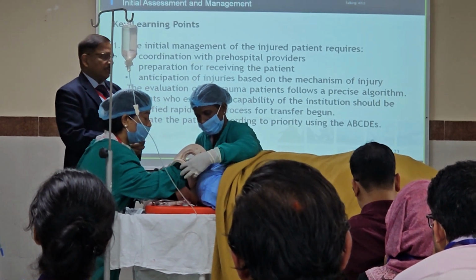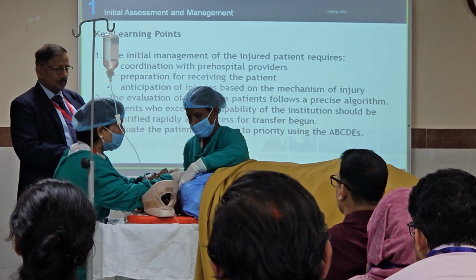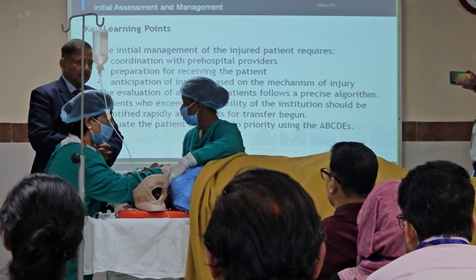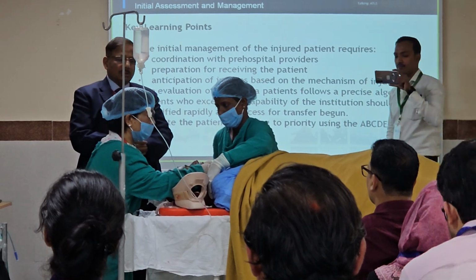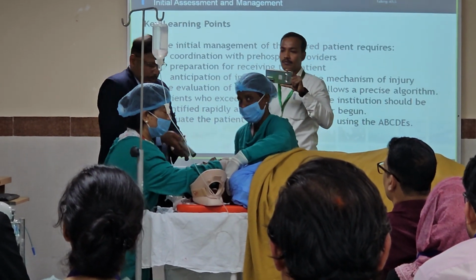What have you done? I am just putting the laryngoscope there, and I have done the suction. And can I see this now? Can you deviate the tongue? Yes, I can deviate the tongue, and I have deviated the tongue. Okay. Can I see the vocal cords now, sir? Should I burp it? You can see the vocal cords.